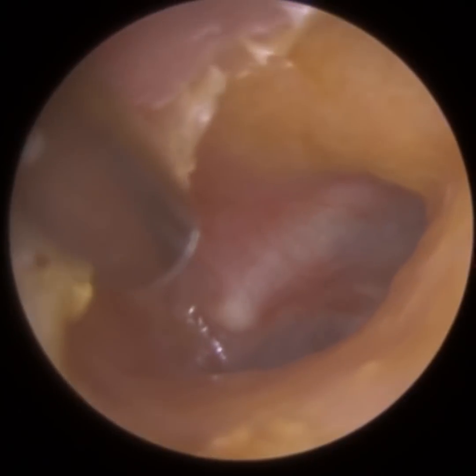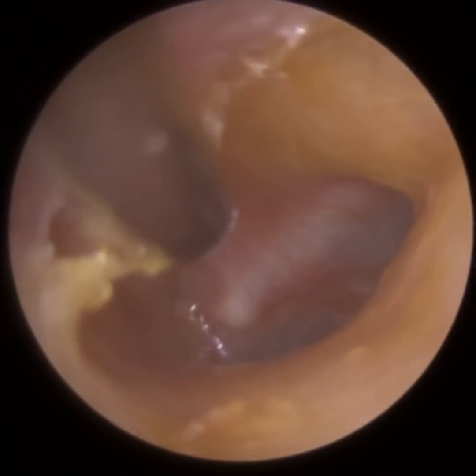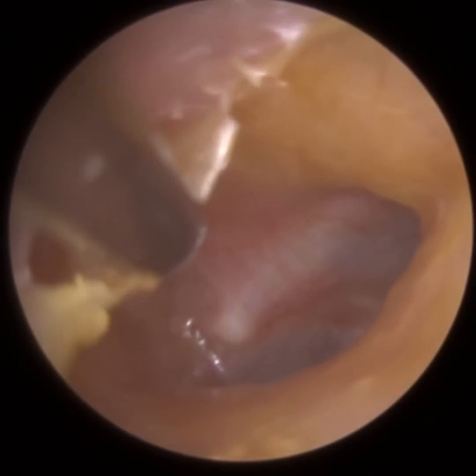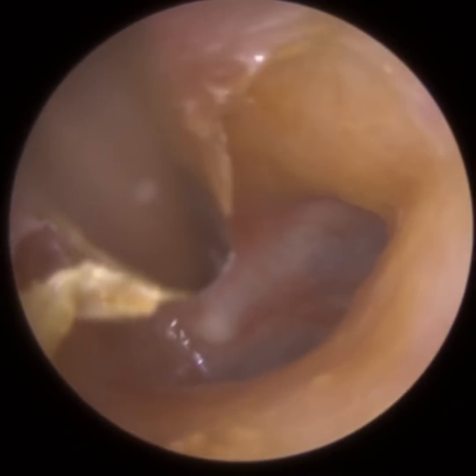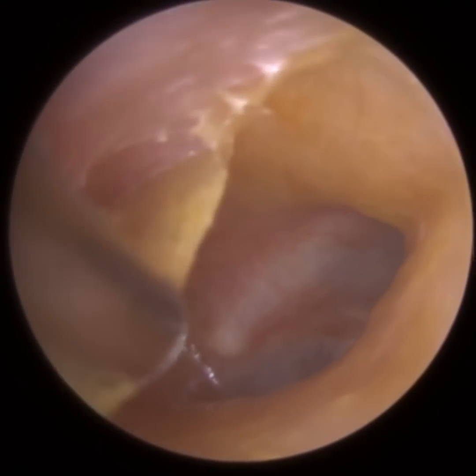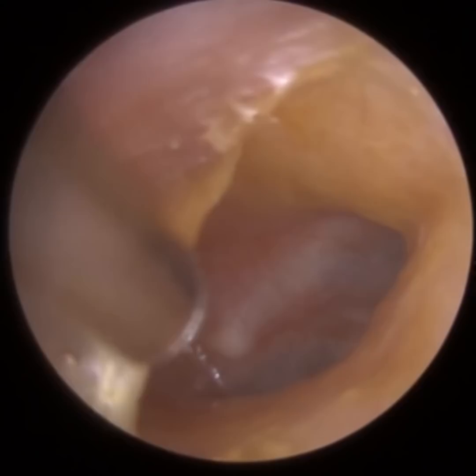The ear temperature has to just come back to normal on the left side, back to room temperature after suctioning, and then the brain's getting equal messages. So we call that the caloric effect. So I'm just trying to get as much dead skin off as I can. So the patient's not yet experiencing the caloric effect, but they will do.